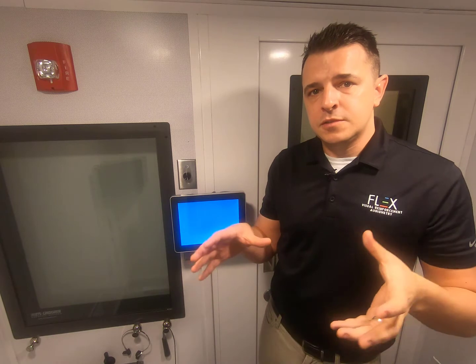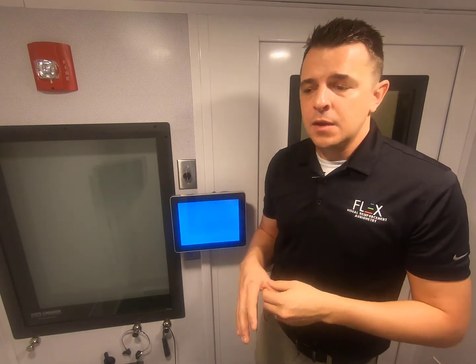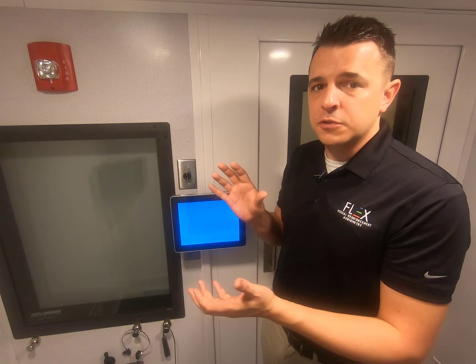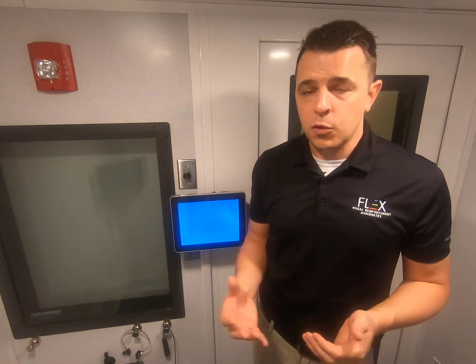we narrowed our stimulus options down to one stimulus, which would be a video of a puppet. We took our display down from a 15-inch on the full-featured Flex to a 10-inch on the Flex Basic, and in doing this, allowed us to offer the Flex Basic at a price point more than half the price of that full-featured Flex VRA.